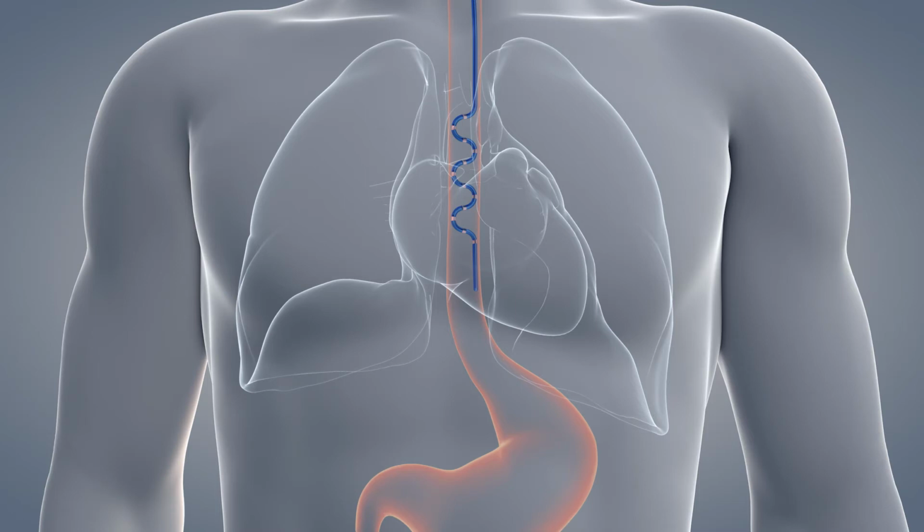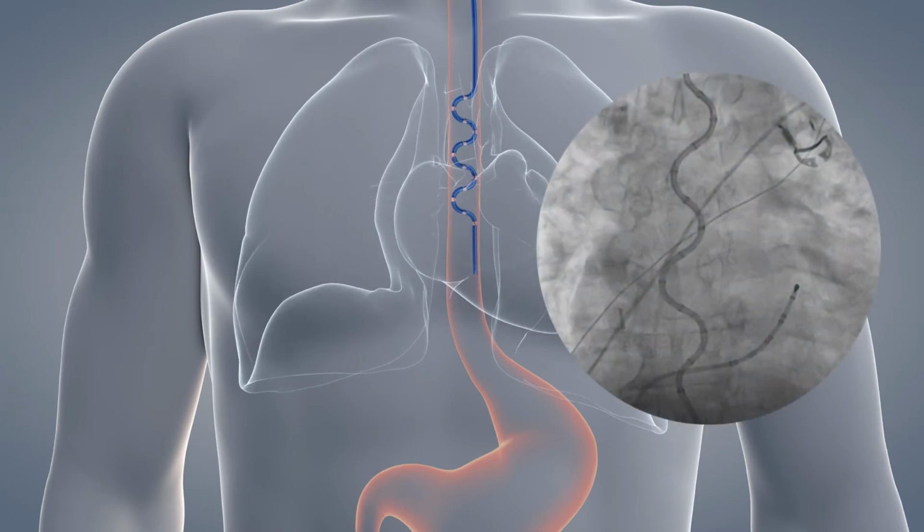Under fluoroscopy, slowly pull the probe back slightly to the proper position. Sensor number 1, the most distal or inferior sensor, should be positioned near the coronary sinus catheter or at the lowest aspect of the left atrium. If the probe end does not appear as an S shape in a straight AP view, grasp the connector housing and rotate the probe until the S shape is visible. Grasp the connector housing to reposition the probe as required for desired placement.